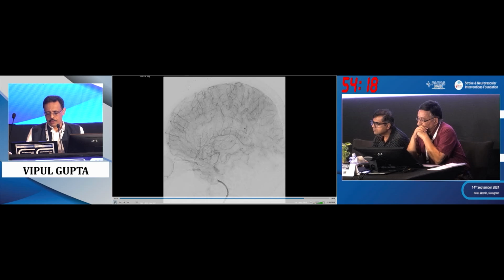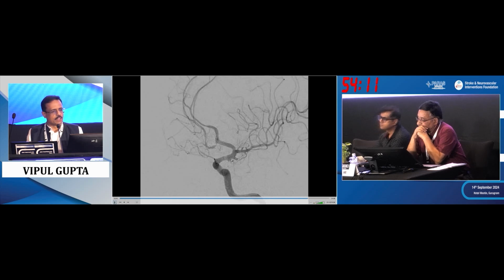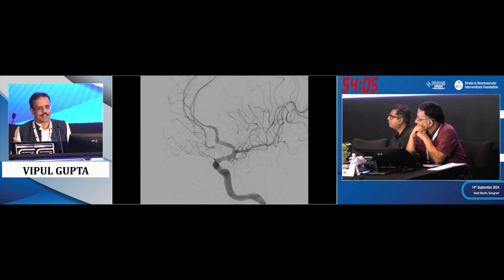All the vessels well filling. But so what do we see in this image? Even in spite of Prasugrel, we are seeing something small, clot formation, and this was surprising. Usually we don't get it. Maybe shelving compressed the stent a lot, becoming like a mini flow diverter in that area.